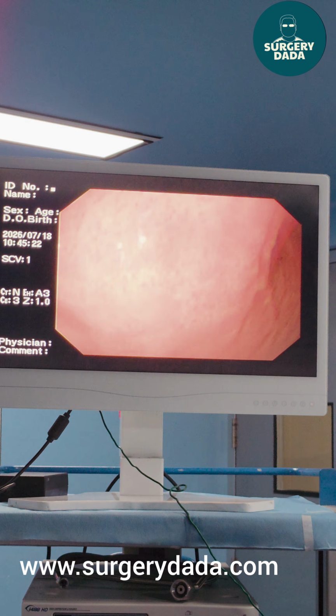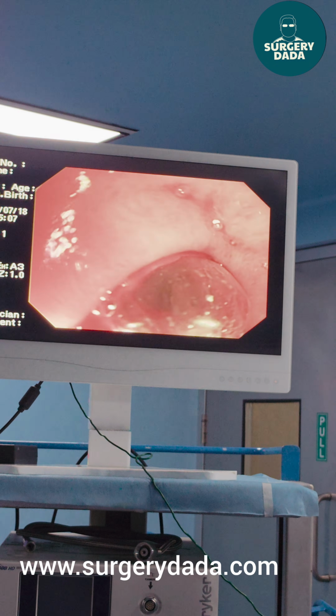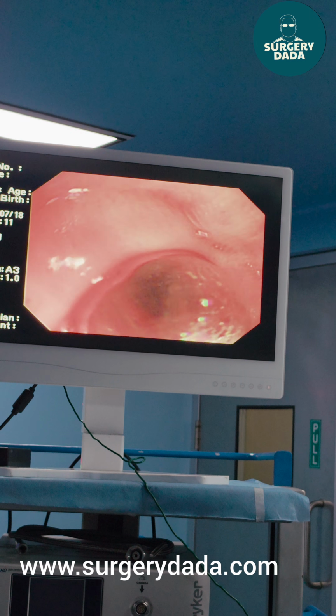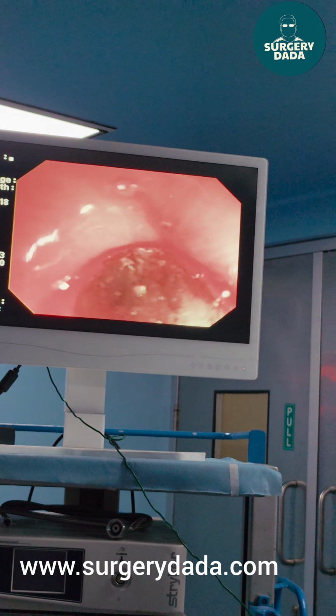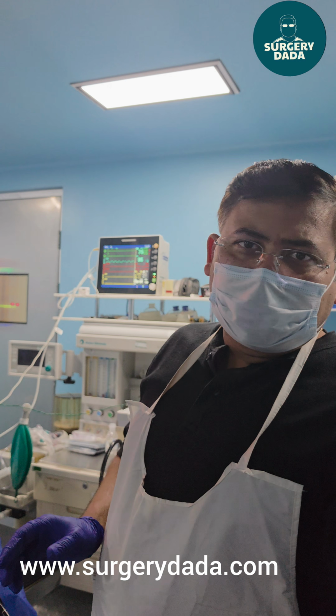Balloon has to be put in again. Okay. So now you can see we have kept the balloon distended, and we'll keep it distended for 30 seconds. The future plan is to go for a stricturoplasty. So this patient is an ideal candidate for balloon dilatation. If it fails, you'll go for a stricturoplasty. If it still fails, then we'll have to do a surgery for this.